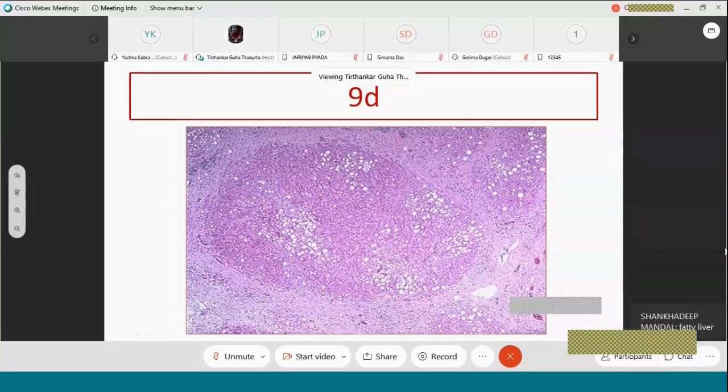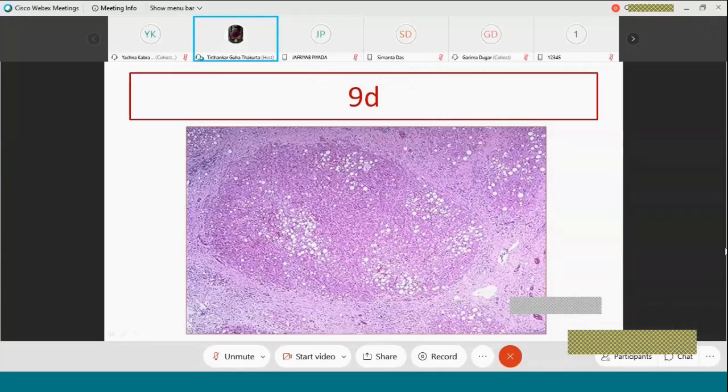So you can see lobules of liver separated by fibrous band, and some of the cells have undergone fatty change. When there are two types of change present together, that is fatty change and cirrhosis together, then only the higher grade of change is reported. So suppose if a person is suffering from an accident and has also died, then the diagnosis is dead. The diagnosis is not accident and dead.